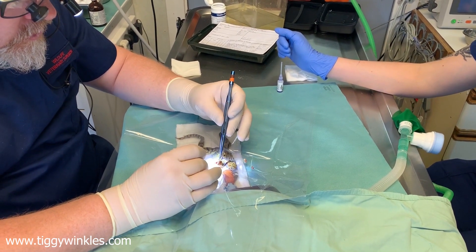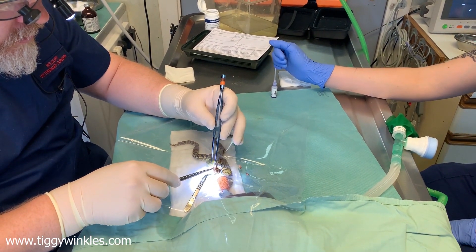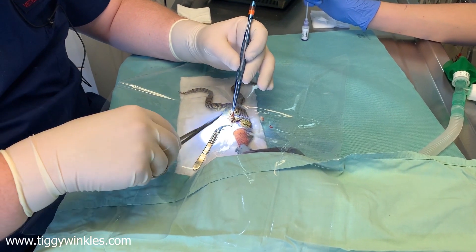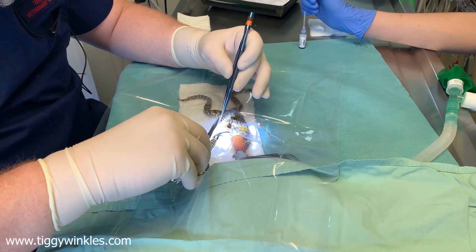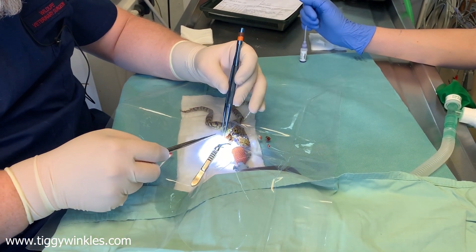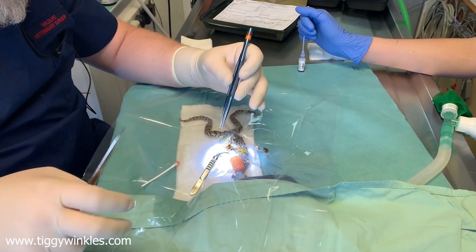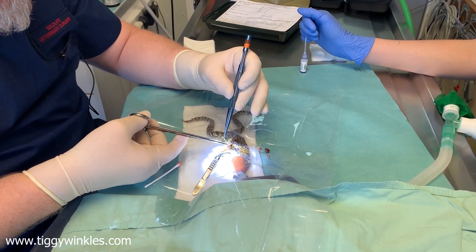Now we just need to work out how much tissue we need to go over the top — not too much. You might notice there are some stitches in this already. During triage earlier, we would have just put a couple of stitches in there to try to cover the end and prevent further damage. We perform an initial assessment with some initial triage just to make them stable and stop the damage getting any worse. We're going to trim this end off first. There's another stitch there — we can just take that out. We've got the remnants of a tendon, which we can just remove because it's not going into the muscle anymore.